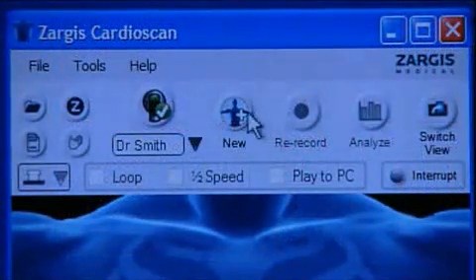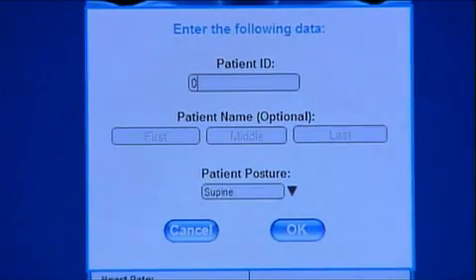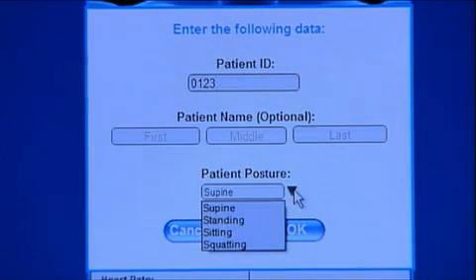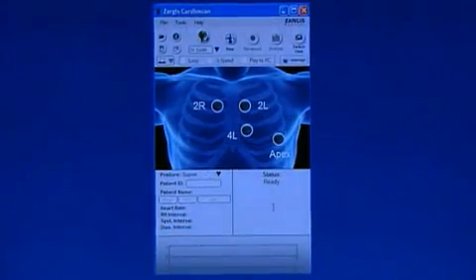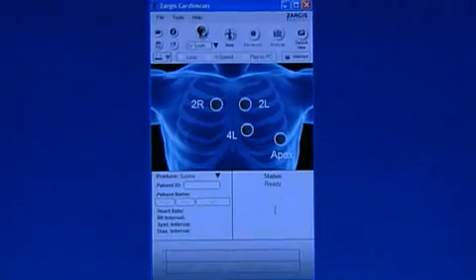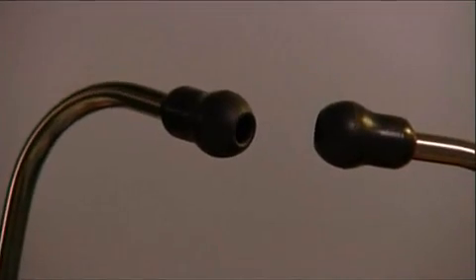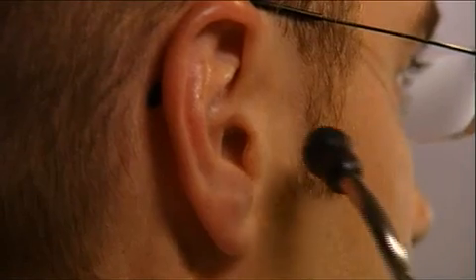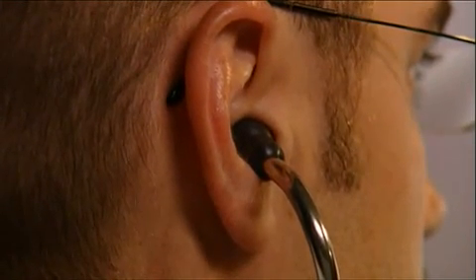Start a recording by clicking the New button located on the center top of the screen. A recording setup screen will appear. Enter the patient ID and, if desired, enter the patient's first, middle, and last name. Select the patient's posture. To use the Zargis CardioScan software diagnostic support capabilities, a specific recording routine must be followed. A voice prompt in the ear tips of your Littmann Model 3200 stethoscope will talk you through the steps during the recordings. Place the Littmann Model 3200 stethoscope into your ears prior to clicking OK on the setup screen.